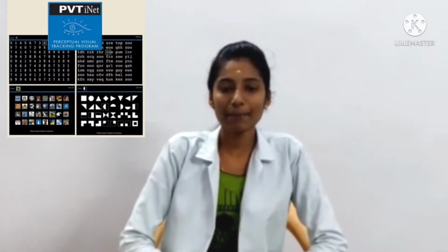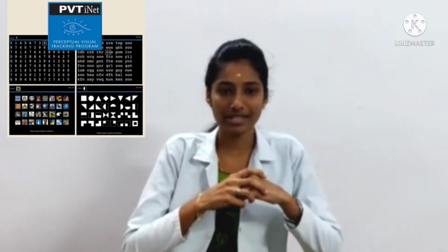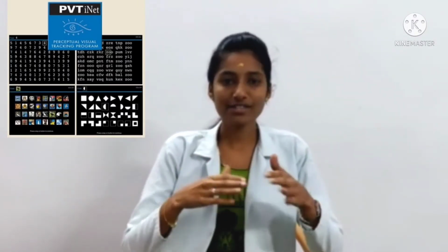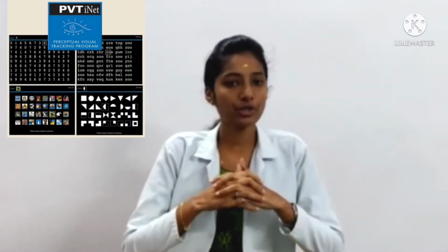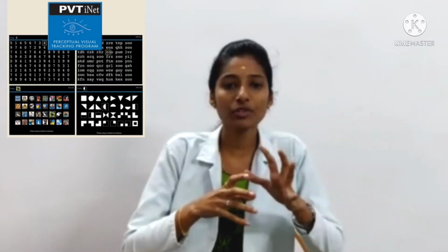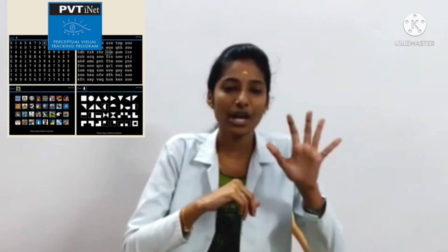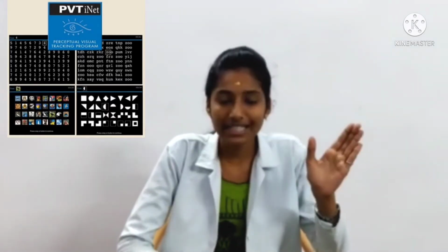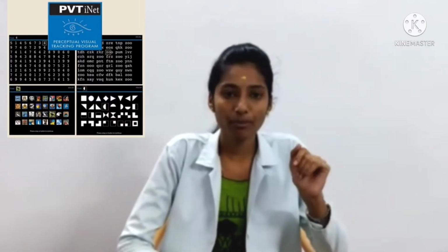The next vision therapy is the computer vision therapy software. The computer vision therapy software is very much advanced. It can be used at home or in the office under the guidance of the parents or guardians. Today we are going to see one type of computer vision therapy, which is perceptual visual tracking. In perceptual visual tracking, we have five types of procedures: matching the targets, moving lines, moving box, hidden targets, and saccadic tracking.